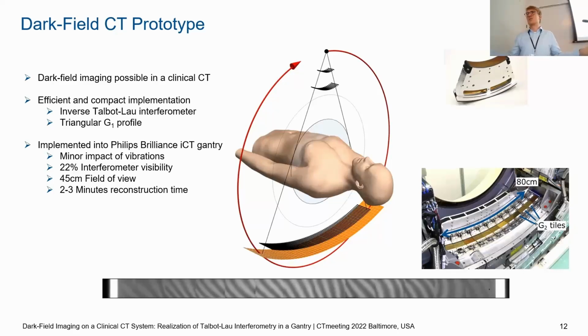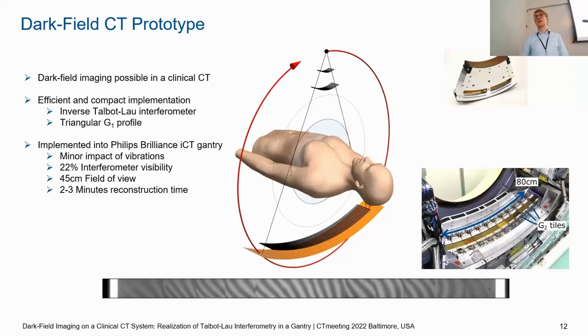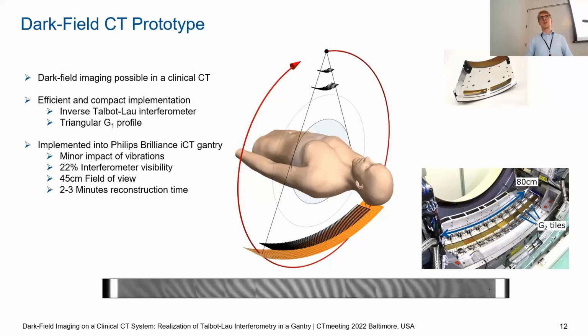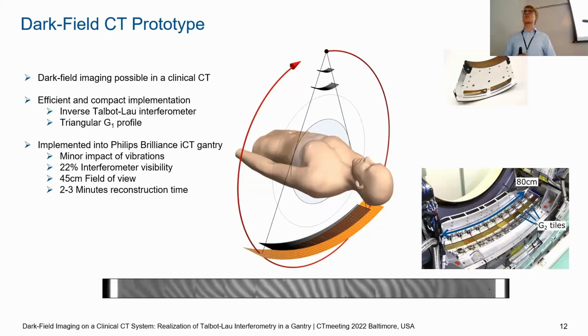But of course we lose like 50% behind the patient, which is a problem somehow, but we can compensate for it by the reconstruction of two image channels. And the absorption images look just like from a regular CT. Resolution-wise, of course, we are not using a focal spot jump yet, so the resolution is still a bit smaller.